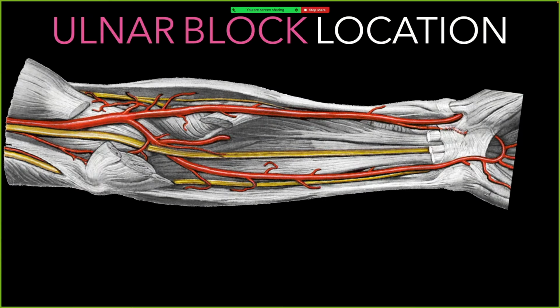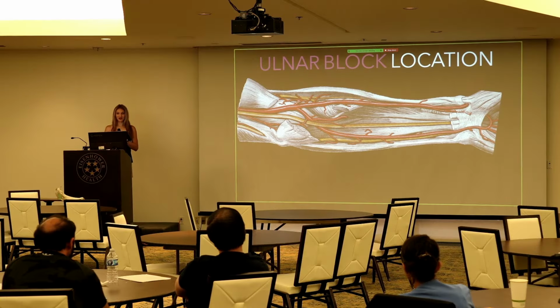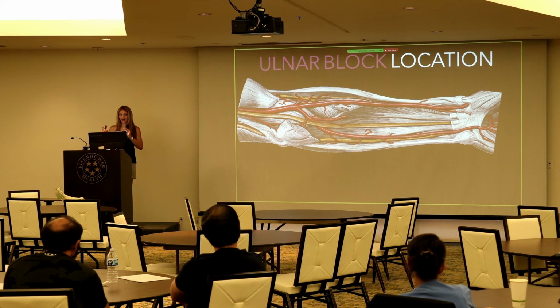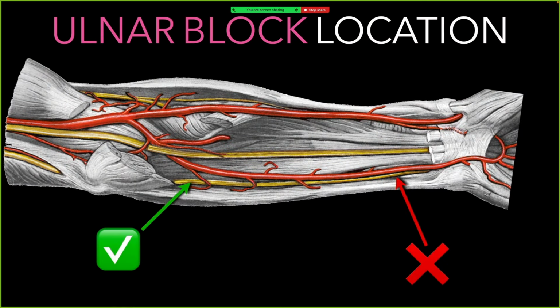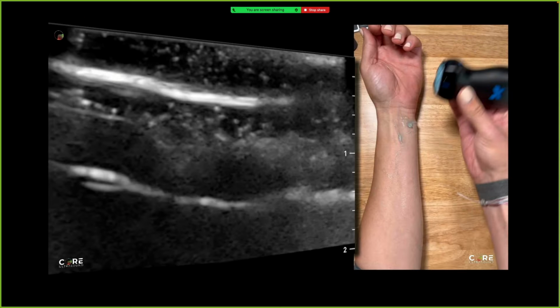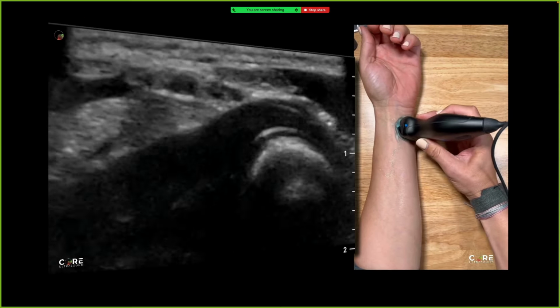The other reason is that the artery is right next to the nerve, and in fact it's a landmark if you happen to be doing this not ultrasound-guided, and please don't. But as you move up the arm, the artery splits off away from that nerve, making it a much safer target, because it's just a nerve in between two muscle bellies. There's nothing else there.